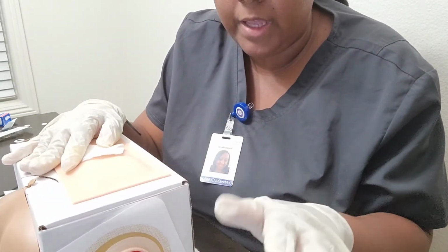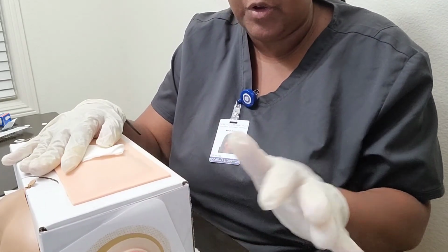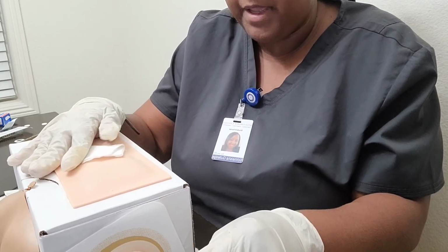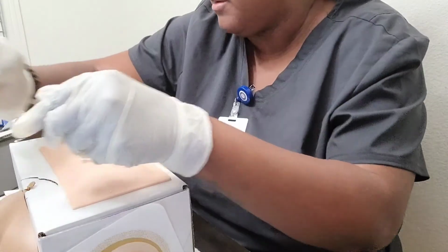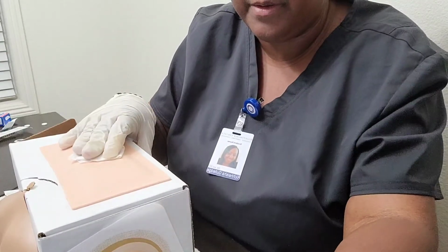I'm not going to recap. We do not recap the needle. I'm going to discard it into my sharps container over here. I'm going to discard it.